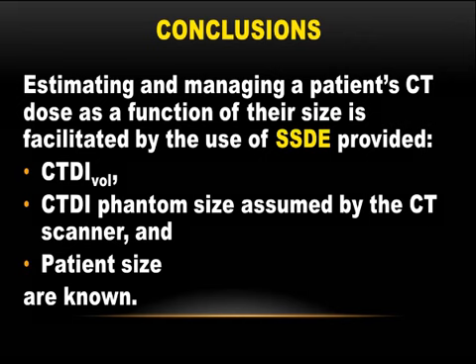I have one question for you, Dr. Strauss, if you don't mind. My question is that you mentioned that age can be used to calculate roughly the SSDE conversion factors. Have you looked at the weight instead of the age? And is that better than using just the age?